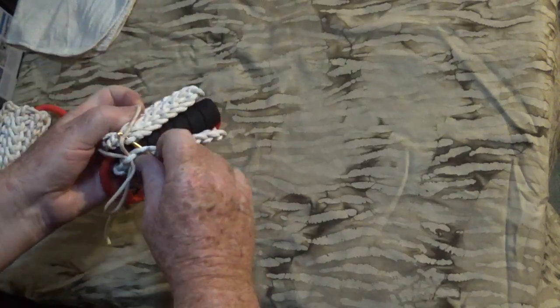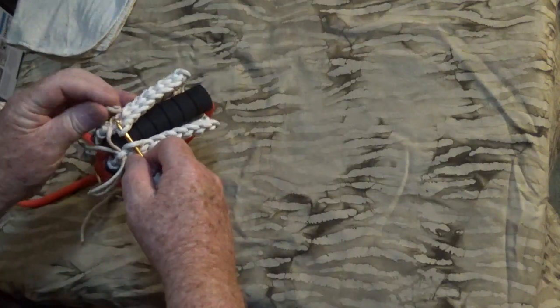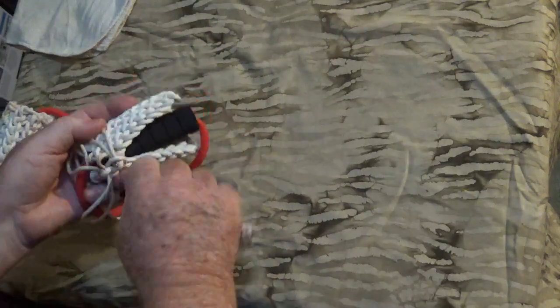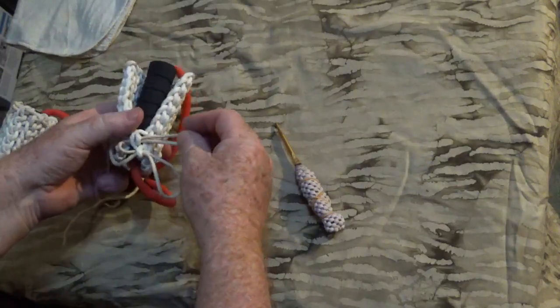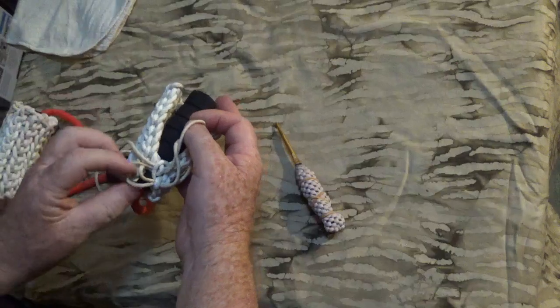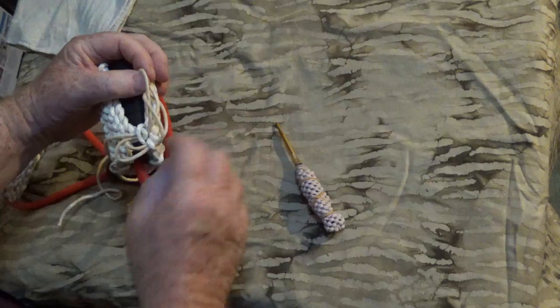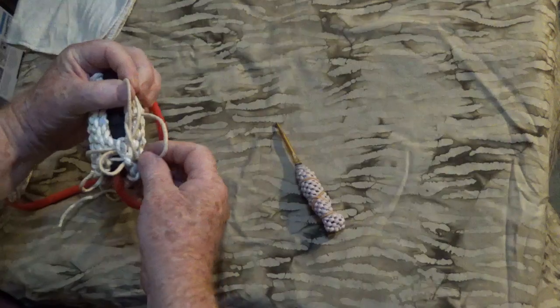On the hook, pull it through the 2 loops, kind of tight. That's why I used a little bit smaller diameter. Get it through the 2 loops. Then bring the new loop inside. Bring it up, and now we're going to tighten this loop up. So here's the knot in. We're going to tighten that up.